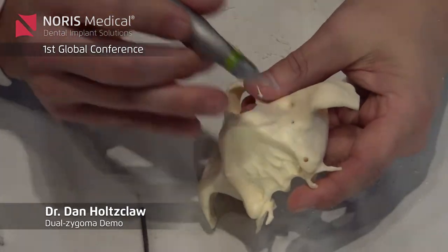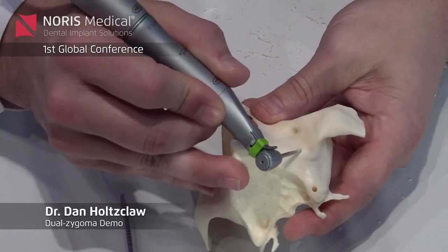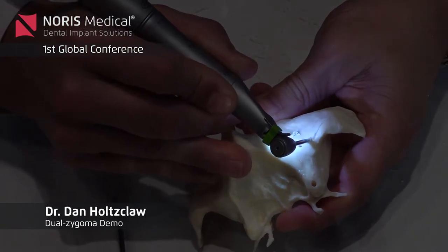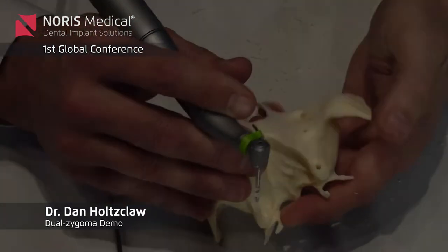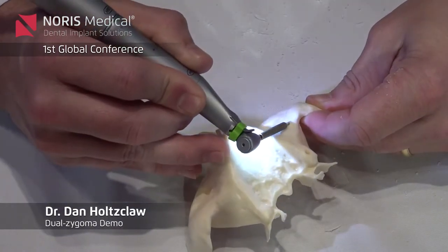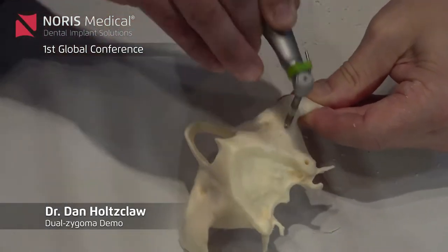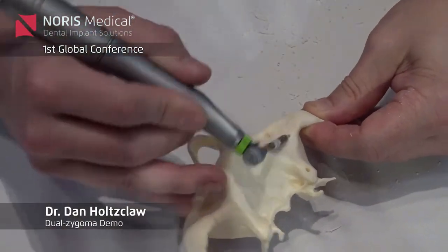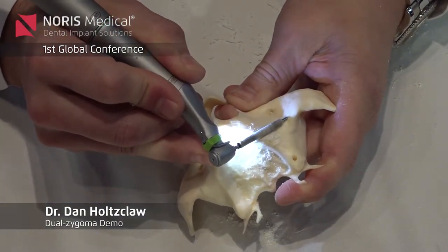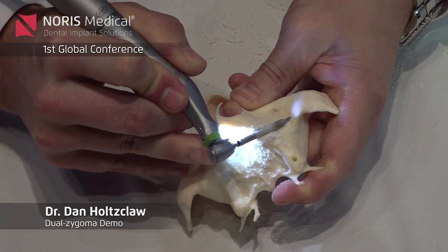Usually in real life the bone is very thin and you'll pop into the sinus very fast. So if you go into the sinus, just go up a bit more vertical. Now I can drill here — all I'm using this first drill for is to make a mark. Say we want to come in at about the second premolar — you see how this gives me control; it's not sliding all over the place. So we'll prepare the channel.